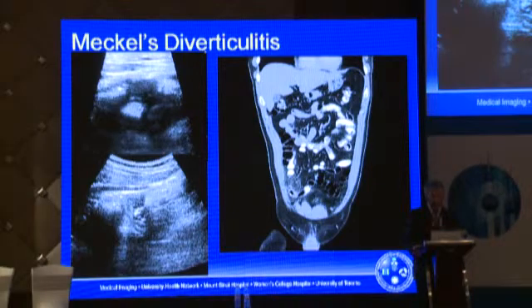And this is an ultrasound we did. We recognized that there was a big problem here, but we couldn't quite understand what was going on. So we don't spend hours in the ultrasound room. We just realize we're not going to solve this one. And then we go on to the CT scan.